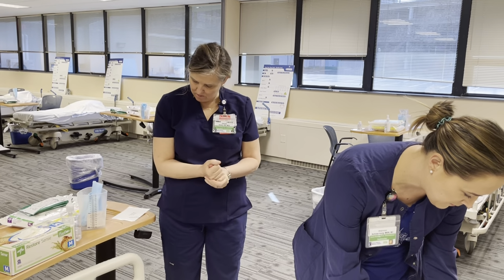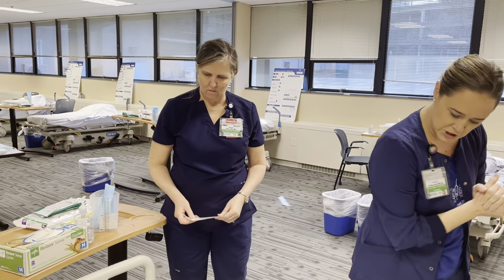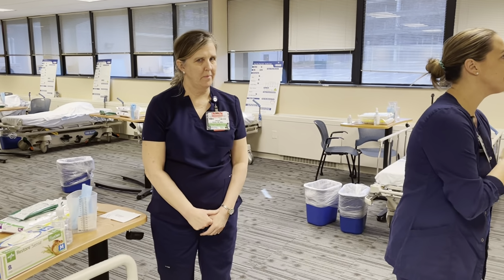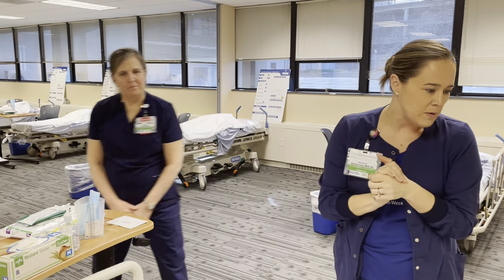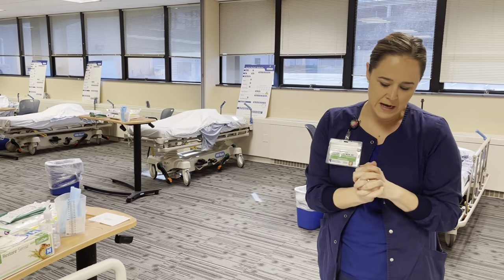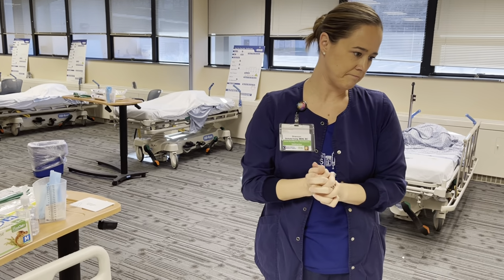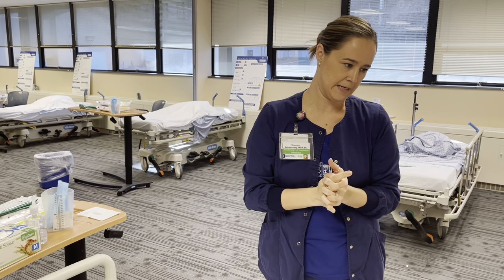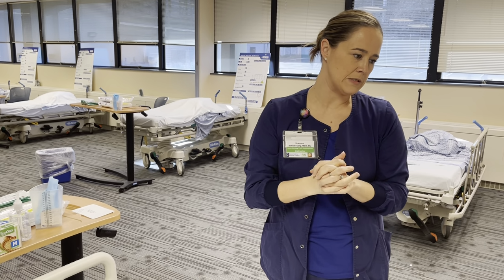Excellent. And I'm verifying the medical record number as well. I will also scan your armband and check your order in Epic to make sure you have an order for your Foley catheter. And I see you do. Sir, we've been asked by your nurse to put in a Foley catheter today. I understand you're going to surgery later. Is now a good time? Sure. It will take about 20 to 30 minutes. Oh, awesome. Sounds great. Do you have any family that will be arriving anytime soon?